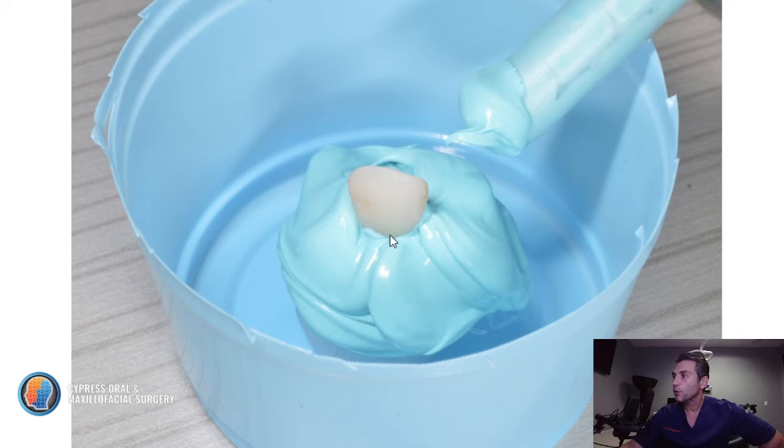You want to fill this up all the way and make sure you don't have any bubbles past the dentogingival junction. So I'll go a few millimeters past that. And if you're patient enough, you can even use light body PVS. The impression is a lot more accurate.